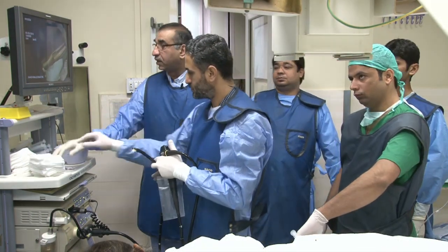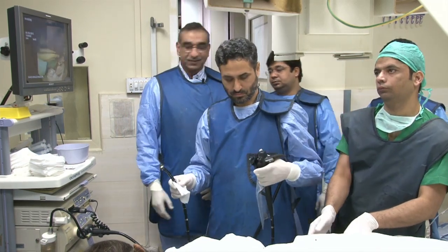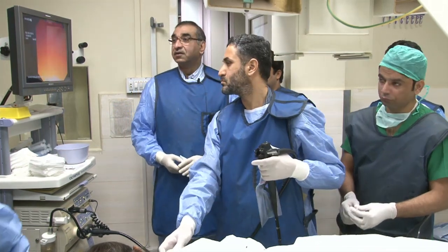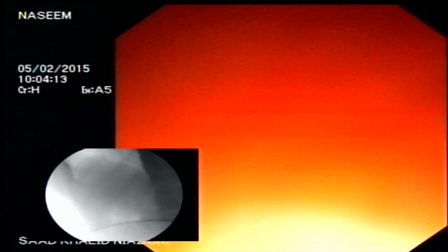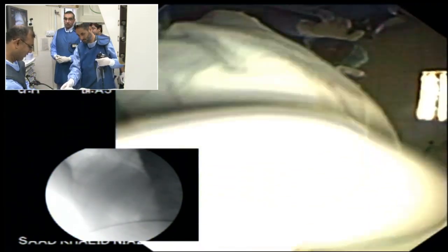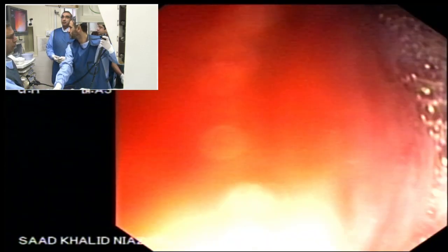Okay, so gently, without covering the lens. Right, okay. Ready? Thank you. Always check with your anesthetist before you start. Chalo. Right, okay, so that's good. Well done. You can look there as well. One of the important things is that your lens should be clear, right? So it's okay now, but it was a bit of a, right.